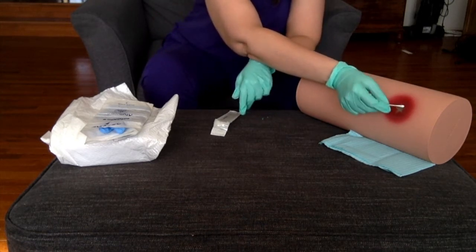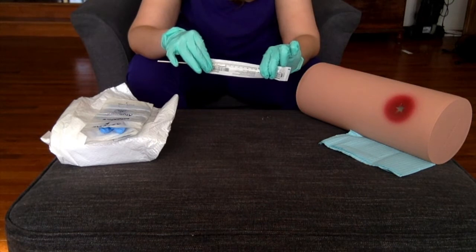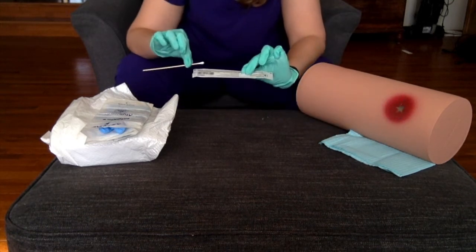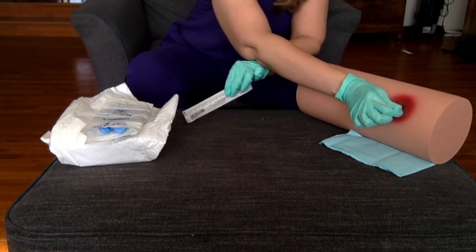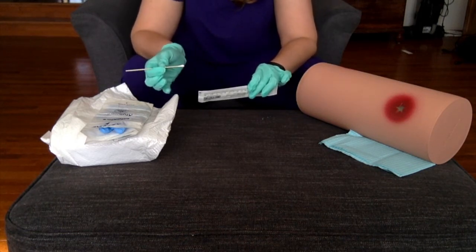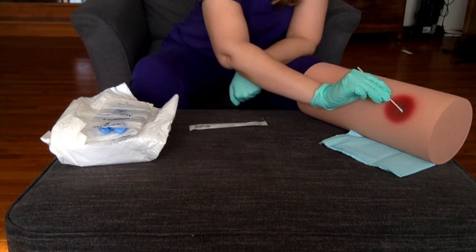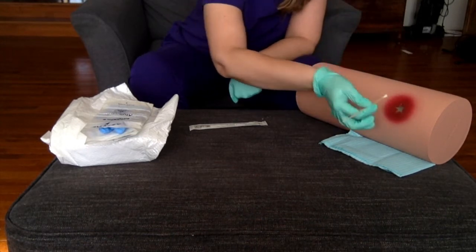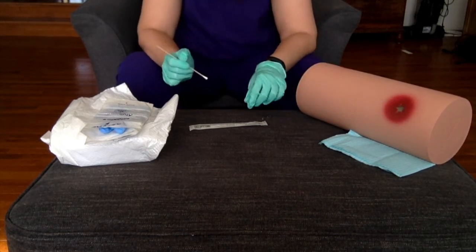You always measure head to toe first. I take my cotton-tipped applicator and measure the largest part — it's about three centimeters. Then I do the width, also about three centimeters. The last piece is the depth: I put this all the way down into the wound and compare — the depth is four and a half centimeters. So three by three by four and a half. I'm also looking at the wound for eschar, which would be dead skin. I'm checking with my Q-tip for any tunneling under the edges, meaning the wound goes under rather than just straight down. This one has no tunneling.